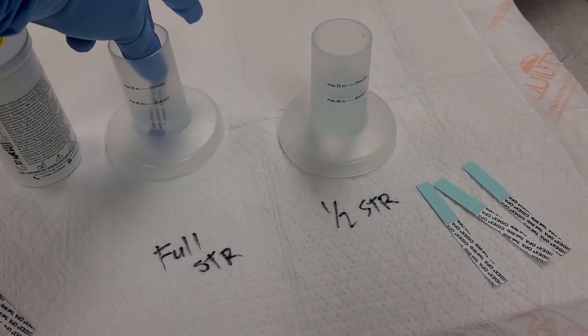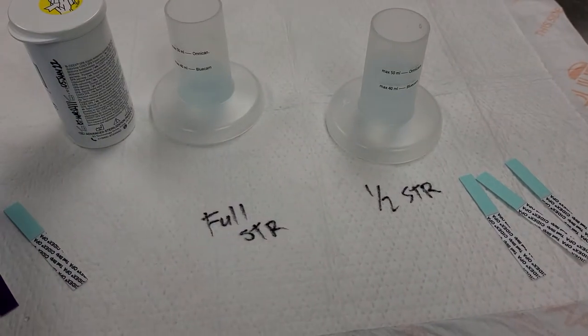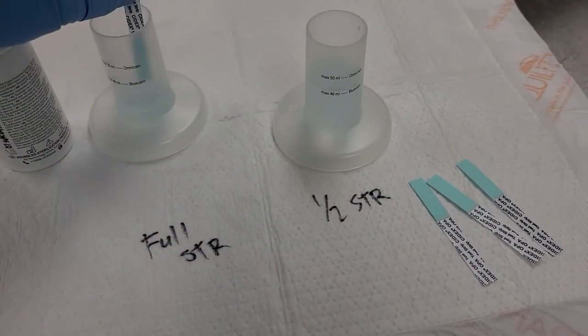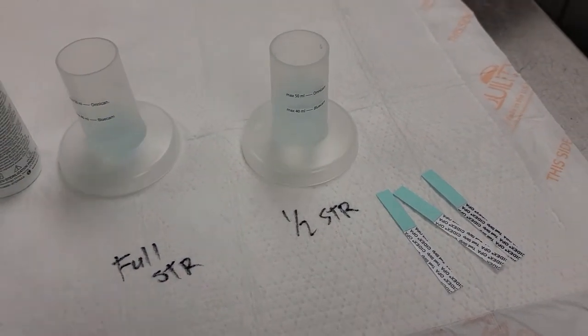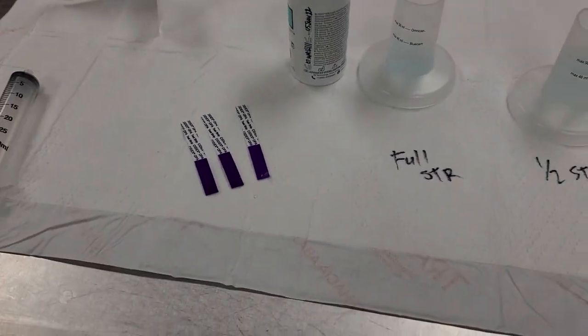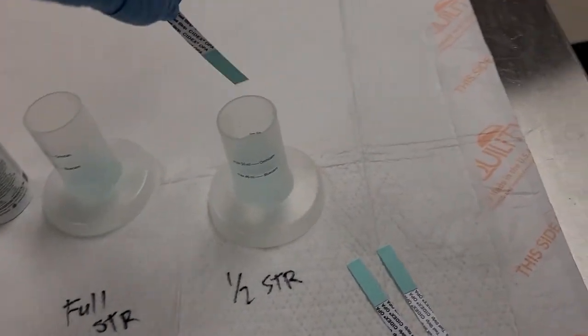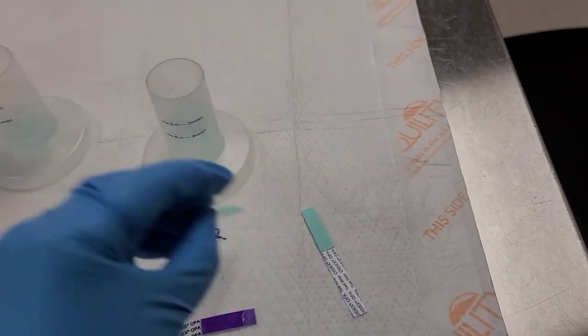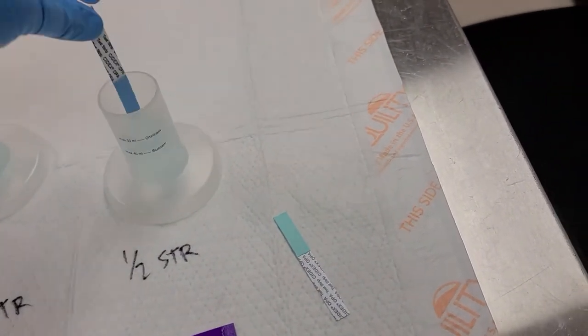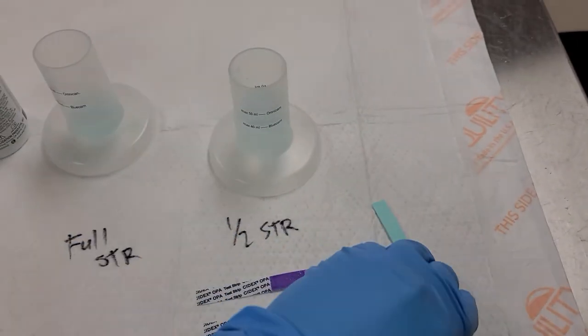So three for the full strength. And you're going to let them sit for 90 seconds. So full strength, it should turn purple. Now the half strength should have a bit of color change, but it should not be as brilliant and it will definitely go back to blue after the 90 seconds.